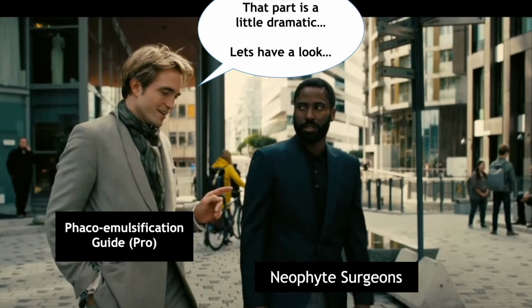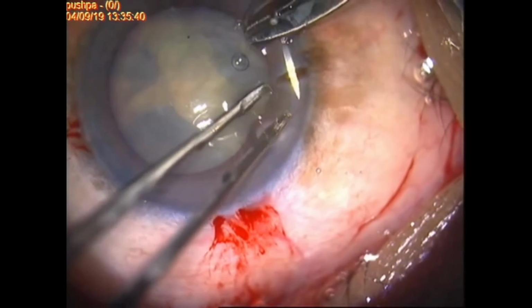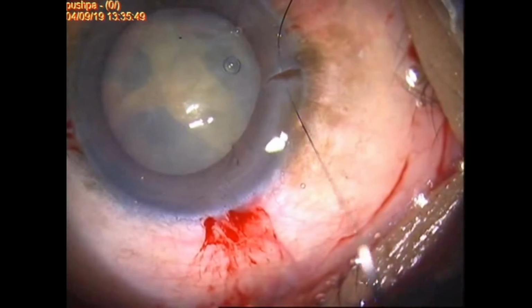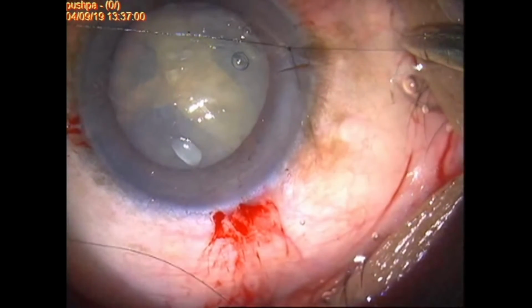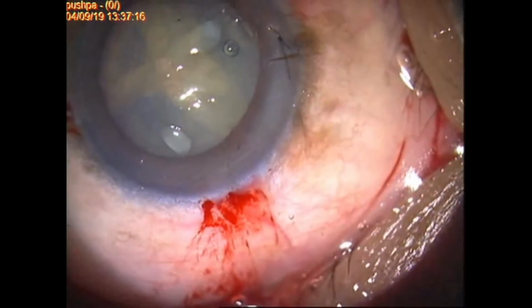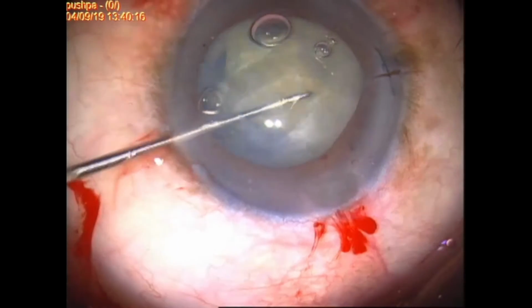Let's have a look. Once that particular complication had happened, I wanted to secure the side port corneal tear to have a steady anterior chamber during phaco maneuvers. Any fluctuation in the anterior chamber will only further propagate the equatorial tears into the posterior capsule. Slow motion phacoemulsification was proceeded to minimize the stress on the zonules.